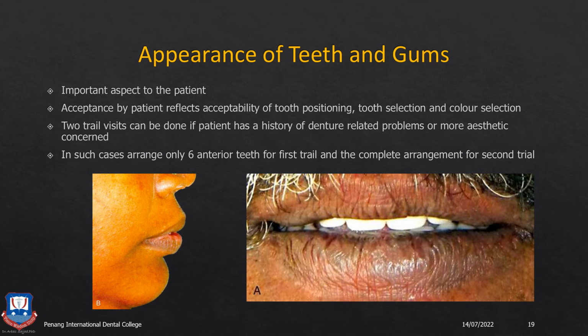So this is an important thing to check and to be incorporated in the final denture before the acrylization. Then you also need to check for aesthetics, that is, proper labial fullness. You should see whether the nasolabial fold is being obliterated or not. You should check for proper cheek fullness. All these things need to be looked at.